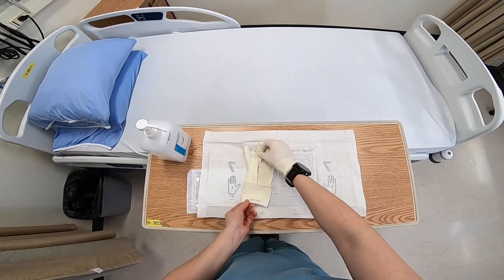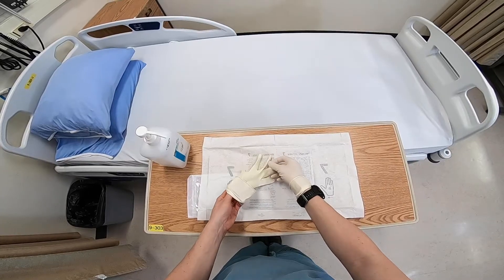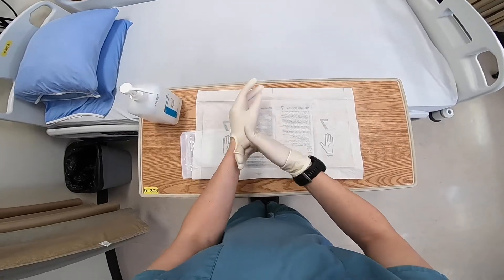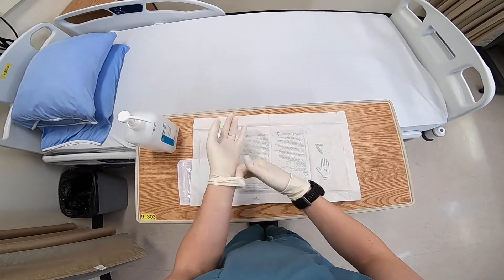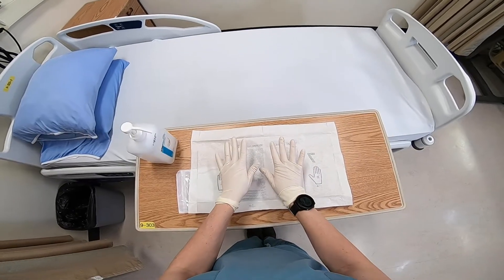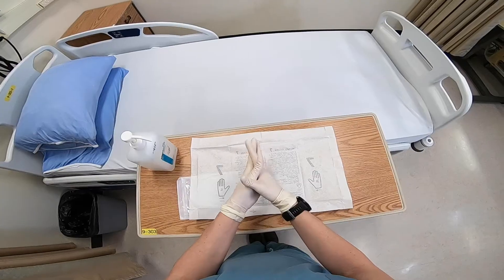Then slip the fingers of your gloved hand under the cuff of the other glove and pull up the glove, while also leaving a cuff at the wrist. Interlock the fingers of both hands together and hold away from your body at waist level. You are now ready to perform the procedure.